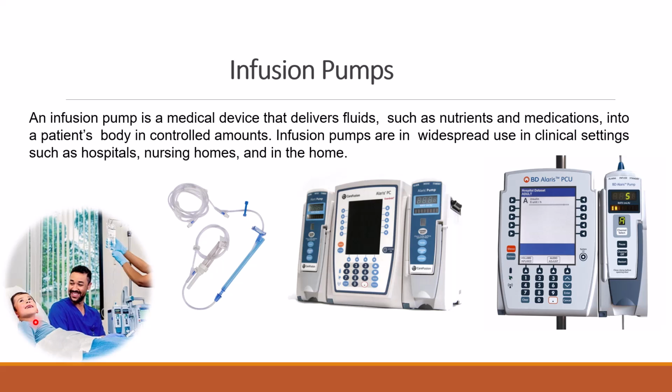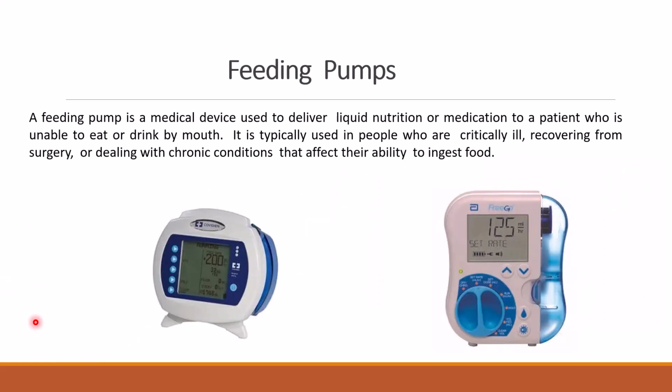The feeding pump is also used for the same purpose. A feeding pump is a medical device that is used to deliver liquid nutrition or medication to a patient who is unable to eat or drink by mouth. We are going to use this device to deliver, for example, milk, nutrients, and sometimes medications to a patient who will not be able to eat through the mouth, especially patients who are critically ill, recovering from surgery, or dealing with chronic conditions.